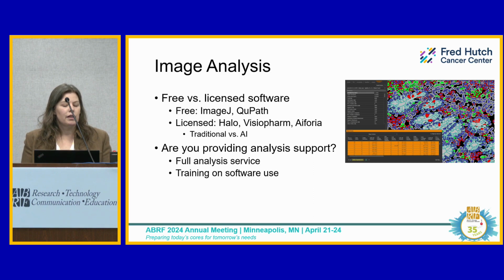And another consideration is, are you going to provide analysis support yourself? There are some cores that will provide full service analysis. So the investigator comes in with a tissue block and they basically leave with their analyzed data. That may be something you're interested in providing. However, a lot of cores will simply train users on how to use that software, and then you can charge the user a fee for service for hourly usage of the software themselves and allow them to do their own analysis.